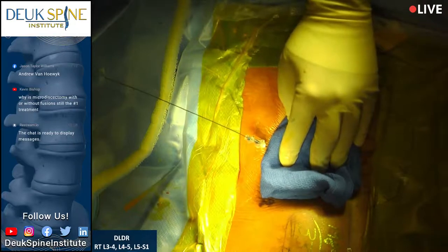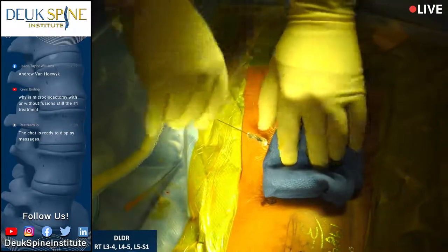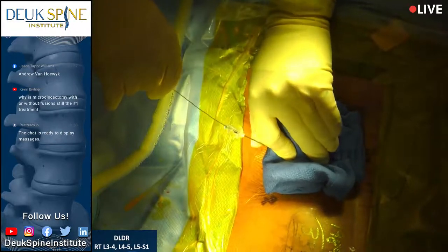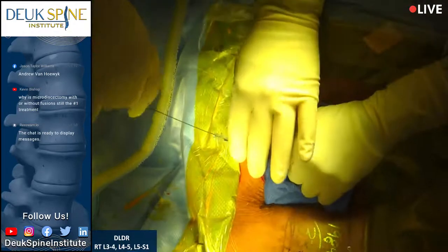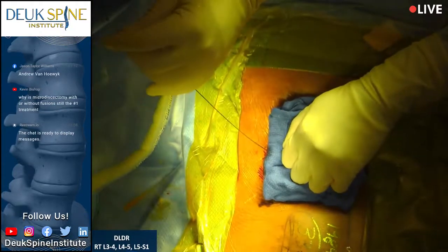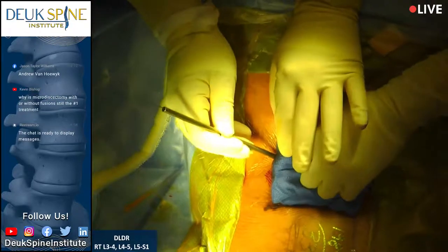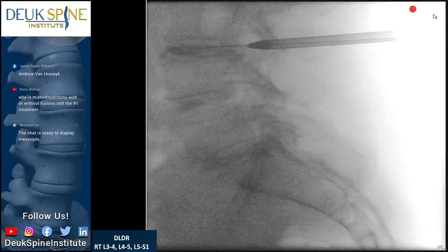Shot. All three of them caused what's called 10 out of 10 pain, which is the highest pain you can possibly get. Hold pressure here. Hard. Good. Let me in. Shot. All right.